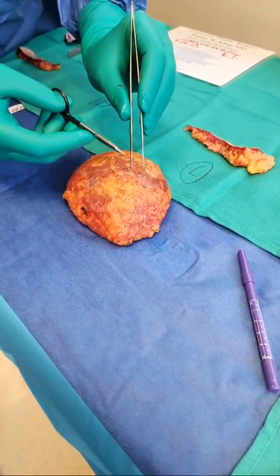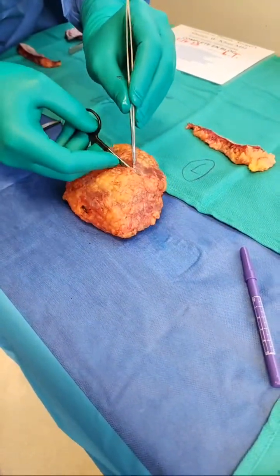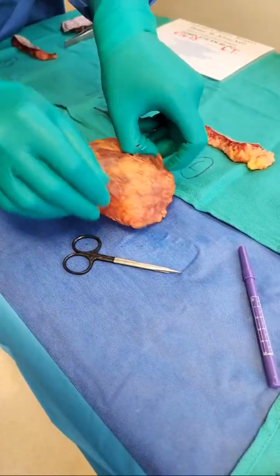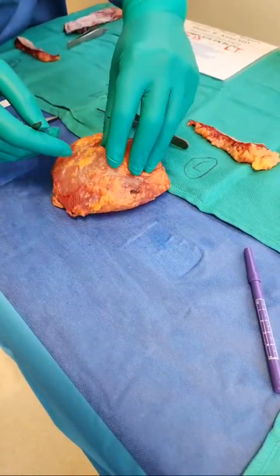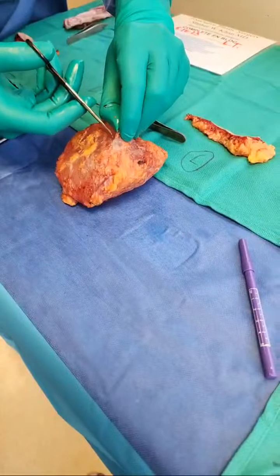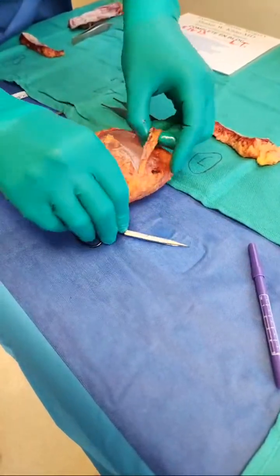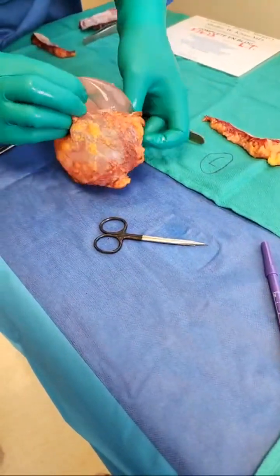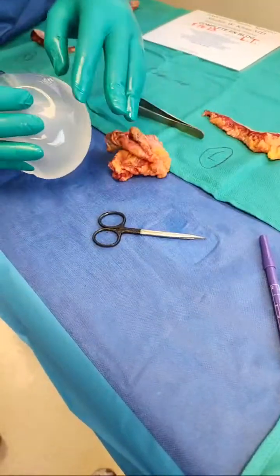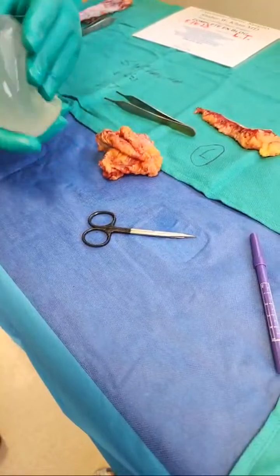But she had this contracture that was giving her a lot of misery. She couldn't wait. She worked very hard and made a lot of effort to come in for her surgery. I couldn't be happier. We did exactly what we planned, without the drains, without any lift. And over here, this is again just fluid.